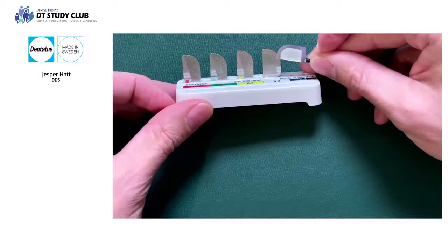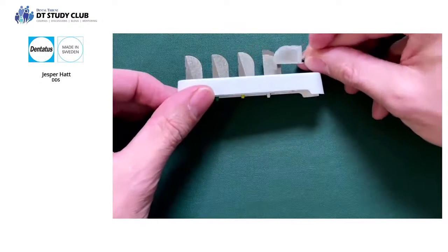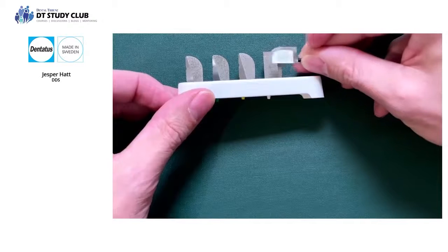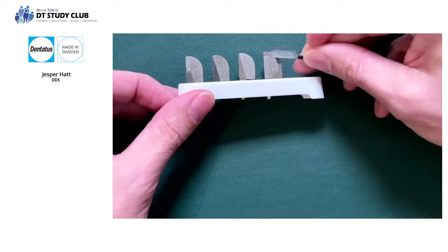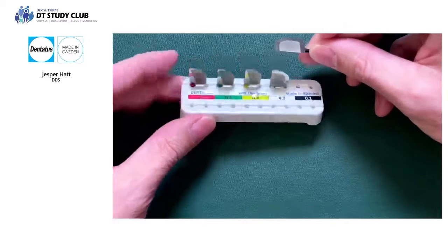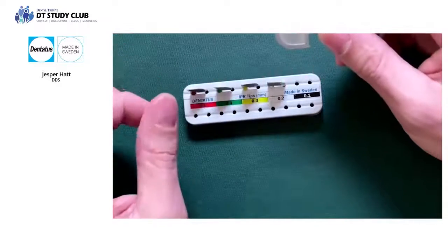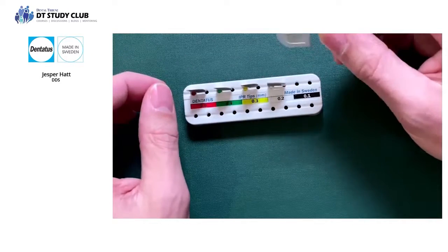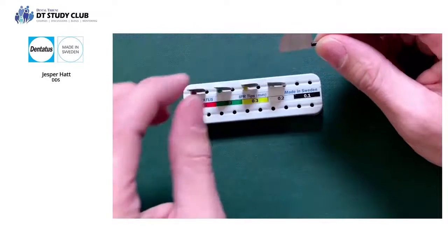The diamonds covering this tip differ a little bit from the others, and that's because this 0.1 millimeter tip has a 15 micron diamond coating which enables it to be used for polishing the teeth.